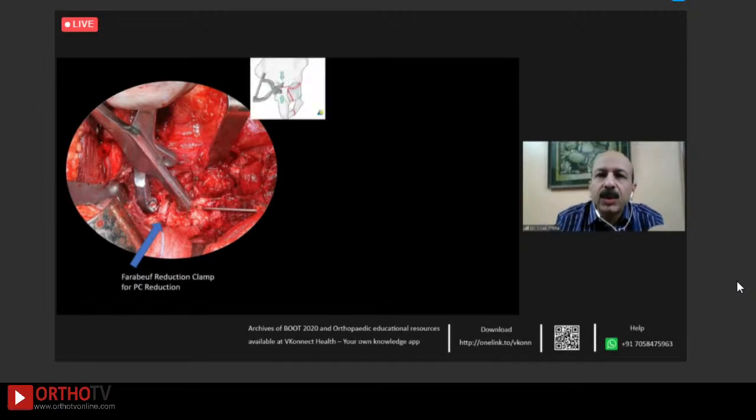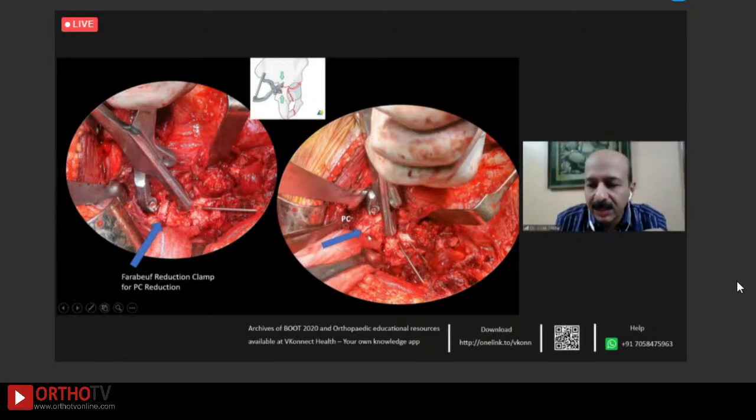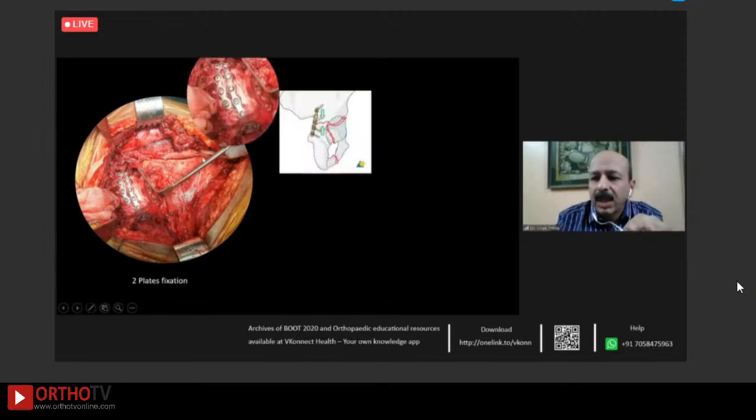So for that, use the Kocher-Langenbeck procedure. Again, the same principle, the simple how-to of a posterior column. Once I was able to get adequate compression, the fixation was done. I fixed it beforehand, made it into a fixed posterior side. And since it was already there, I did a flip osteotomy now and fixed it.